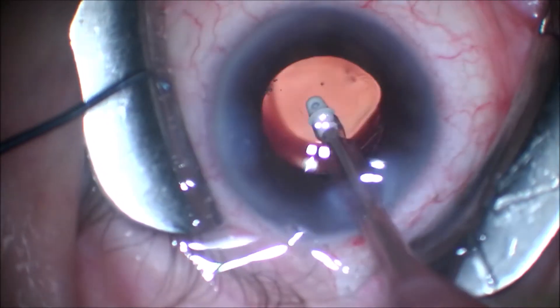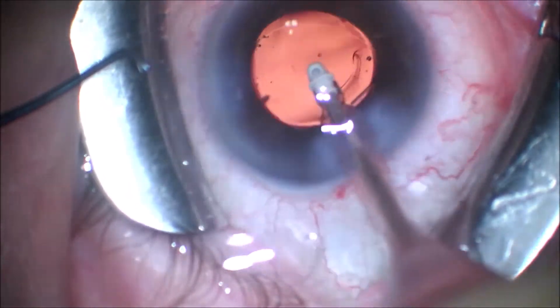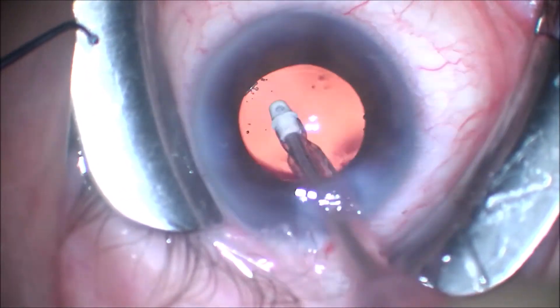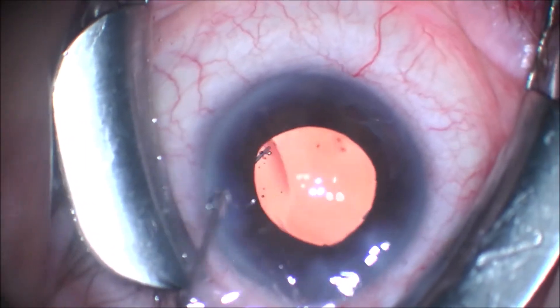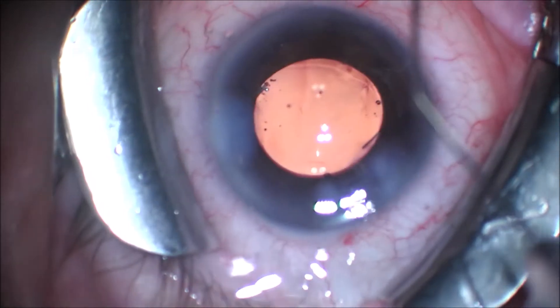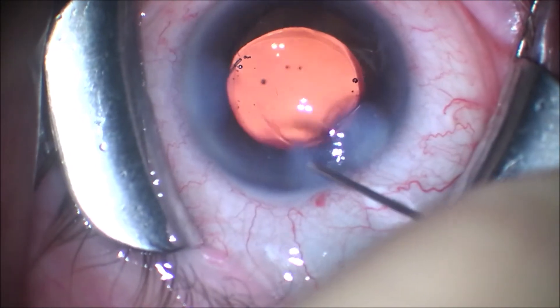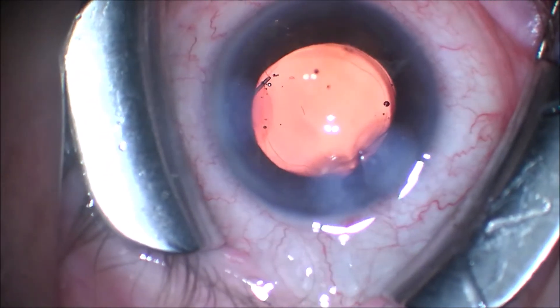This combination goniotomy and stenting of the trabecular meshwork will significantly lower the intraocular pressure after cataract surgery. And because of the small openings in the trabecular meshwork, it may not have the same complications as a goniotomy using a 25-gauge needle or other knife or device. This is a very elegant way to perform a goniotomy in a controlled fashion.